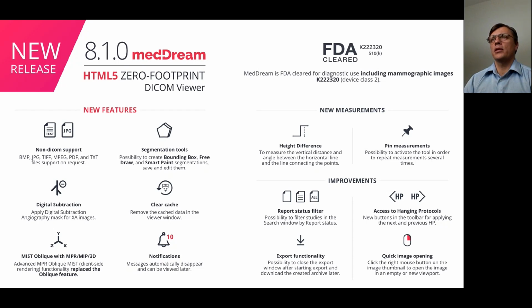So we expect in version 8.2 to complete the orthopedics measurement section and cover all needs of orthopedics. We are also planning in version 8.2 to release an official document on our website which shows and explains to all our customers what orthopedics can be fully completed with our measurements.